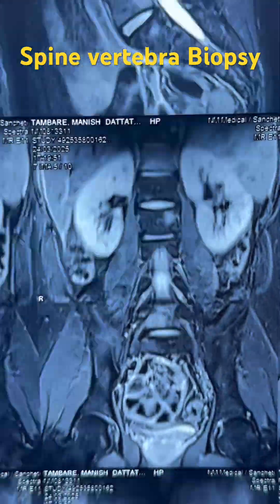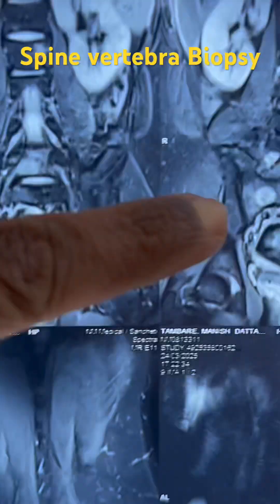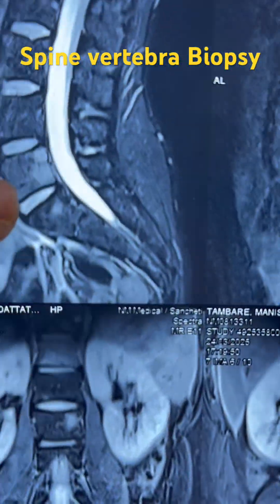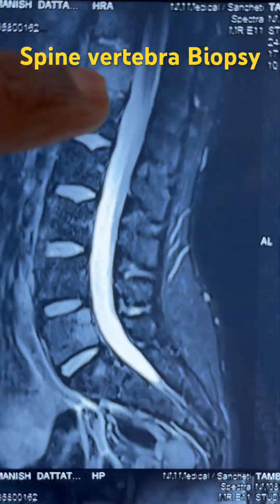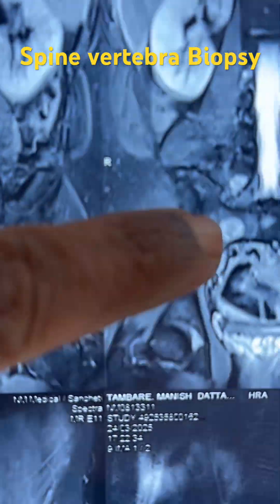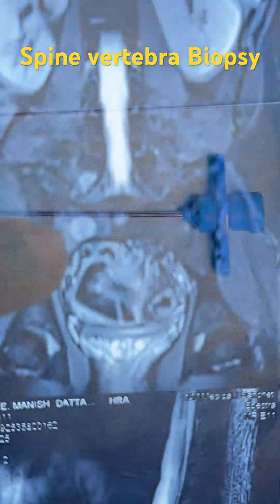This is a young patient who has a lesion in the right sacrum, the L5 vertebra, and the L1 vertebra. We are planning the biopsy through the L5 vertebra and through the right sacral ala.